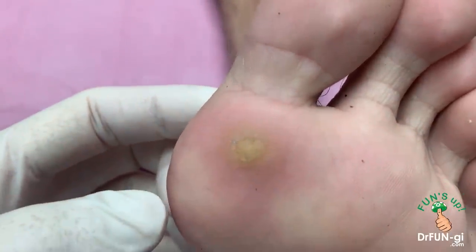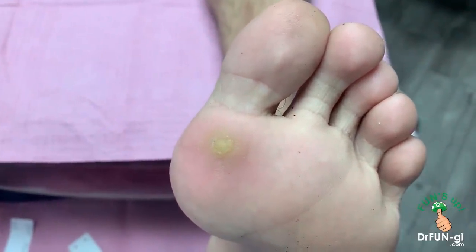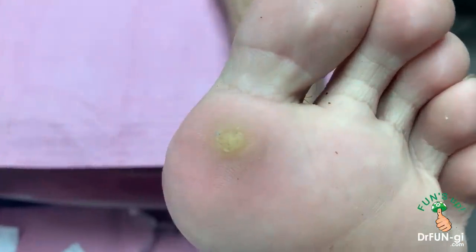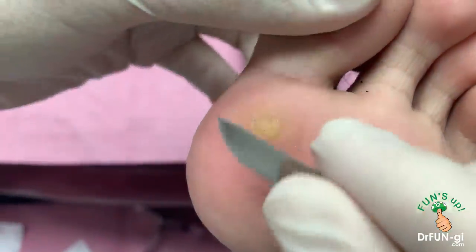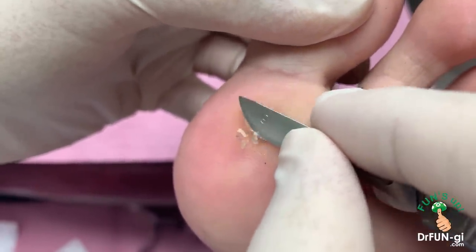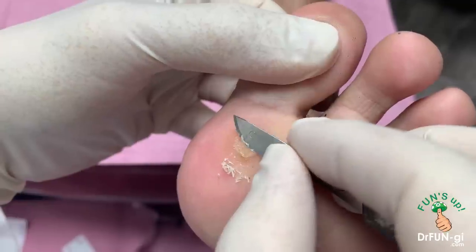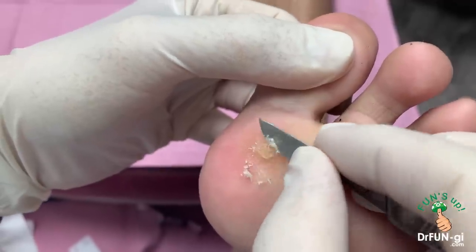So I'm going to do some laser first. I'm going to clean it out a little bit first so that the laser can penetrate and kill the virus in this area. Anything that grows in your body — virus, fungus, any other bacteria, or even cancer cells — don't like heat. So that's what we're doing. We're going to heat this area and hopefully some of the virus will die.